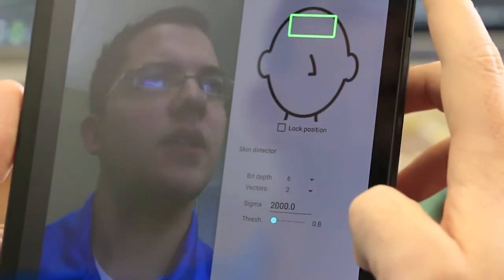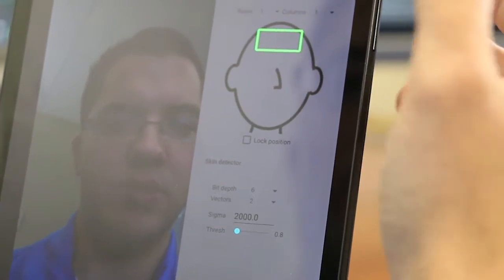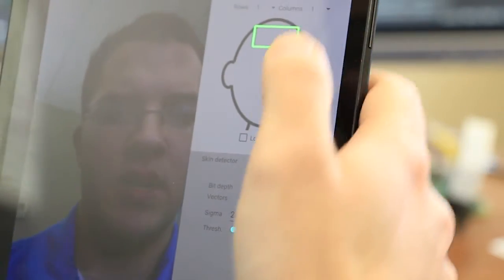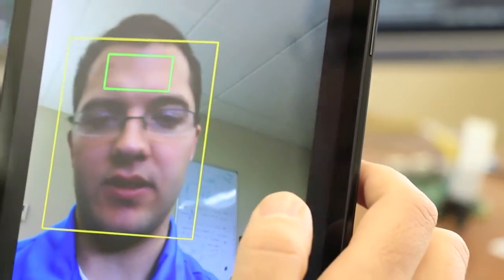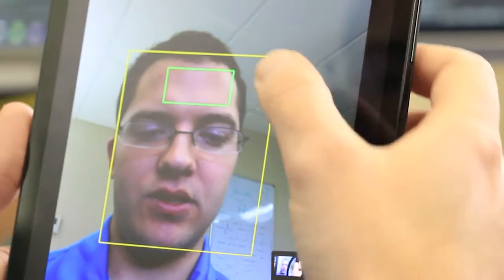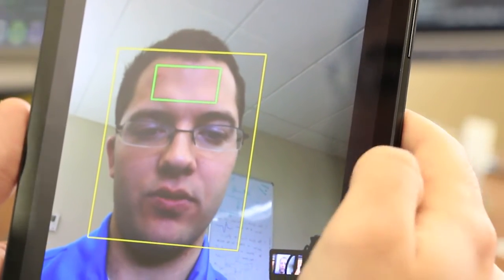Now this pane deals with how we actually compute the heart rate, or how we get the pixels to compute the heart rate. In every frame of a picture, I want to find the pixels that are associated with the skin, add all those together and find the average red, green, and blue, which I'm going to, for every frame, feed into a time series signal, and then feed that into my algorithm. So we have a couple different ways in which we can get those time series signals. One is to just place a region of interest on my face, a box relative to a face detector that I'm using, and inside this green box are all the pixels that I'm going to add up and get the average colors for.